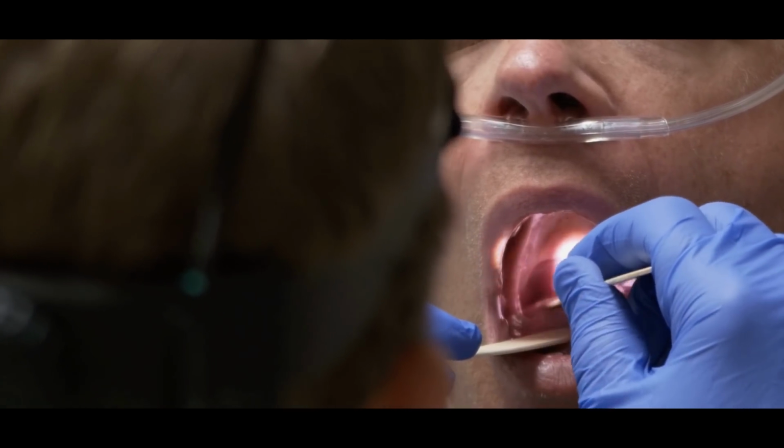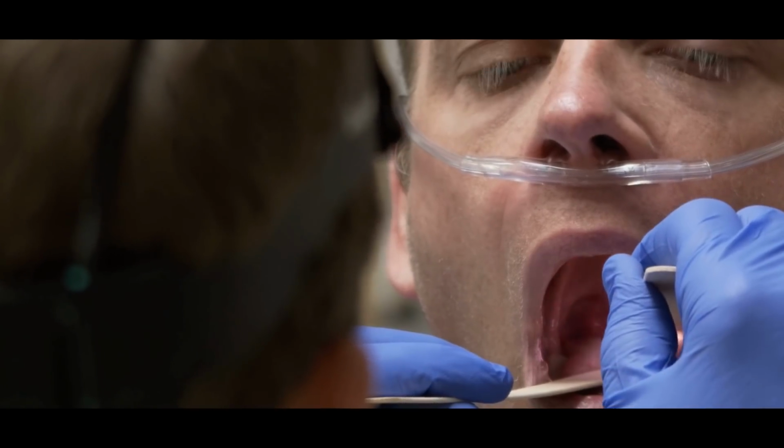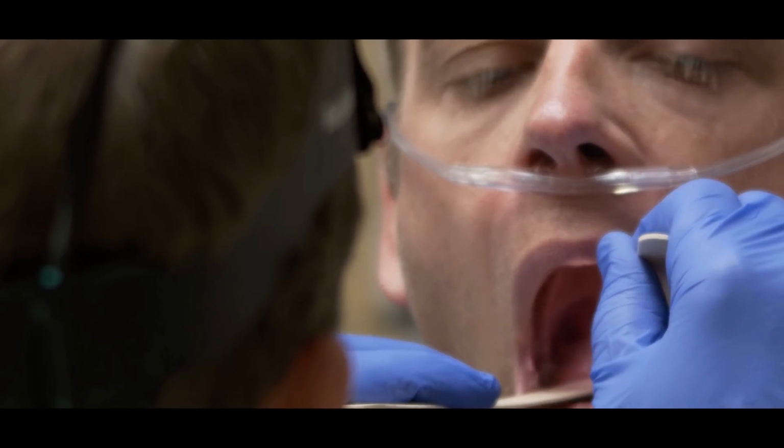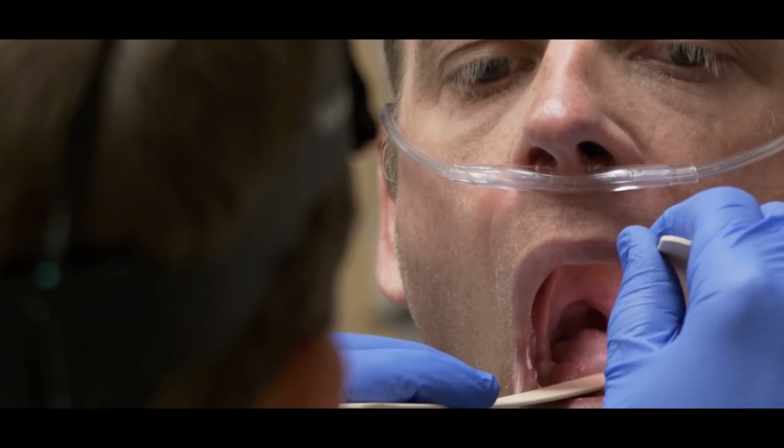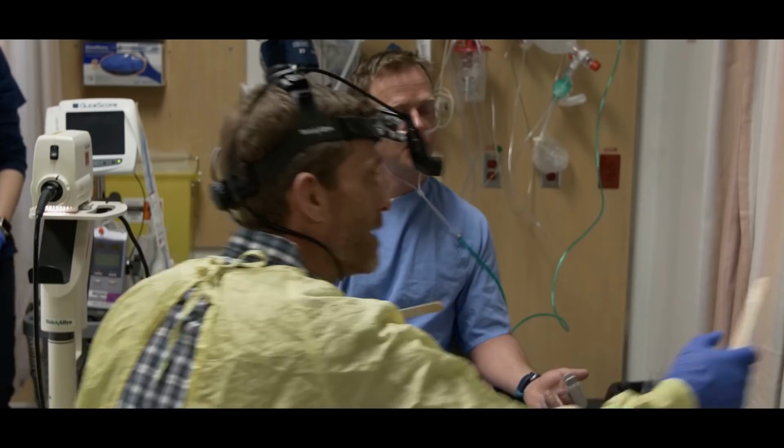Leon, if you wouldn't mind opening that gauze there. And we'll kind of trap the tongue with that gauze. Yeah, that was the uvula I just touched there. And thank you.